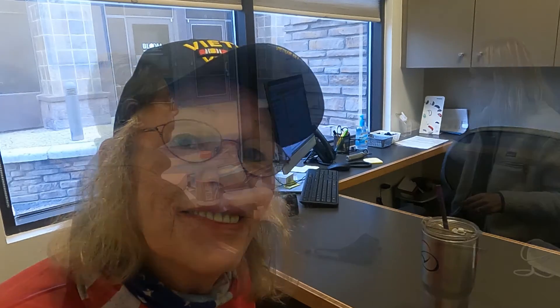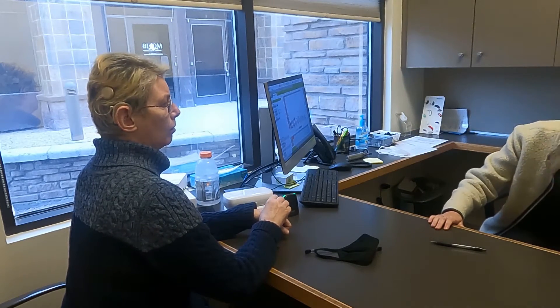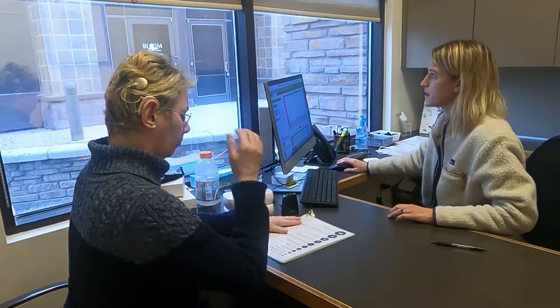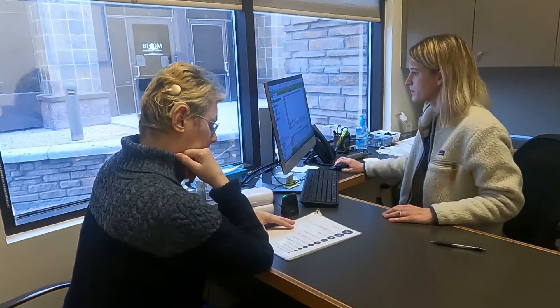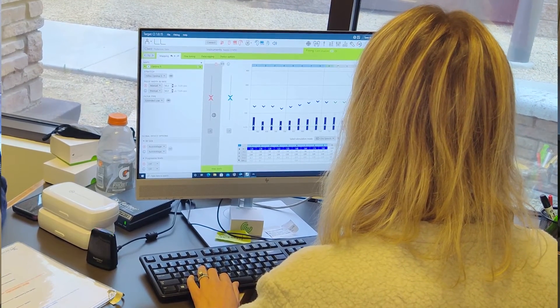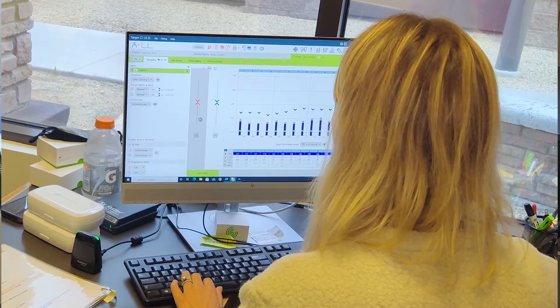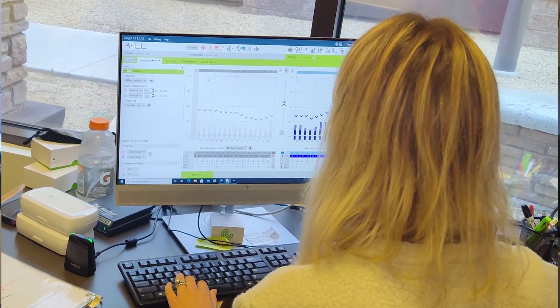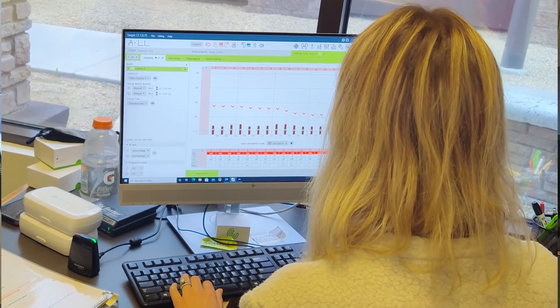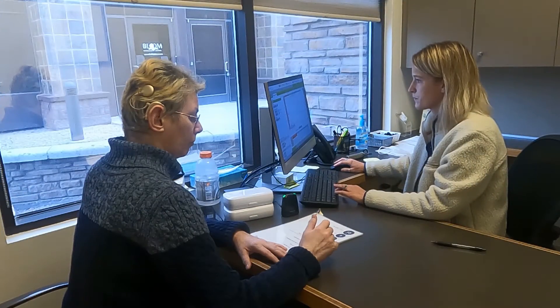I'll have you do a loudness scale — I'm gonna play sounds and I want you to tell me how loud they are. You can just tell me what number you think the sound is. I'm gonna start in the right ear. It's soft... I can hear it. Too soft. A couple soft. Comfortable.